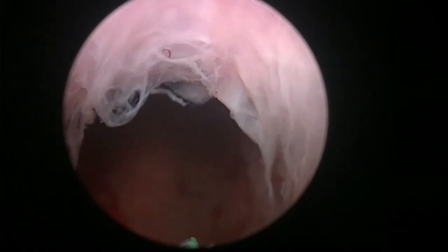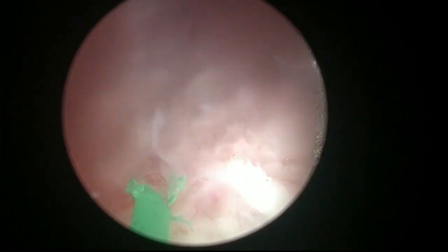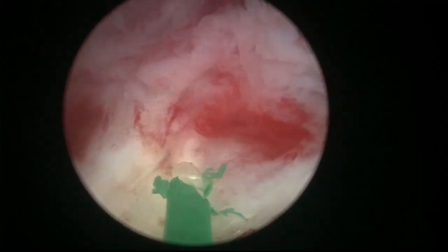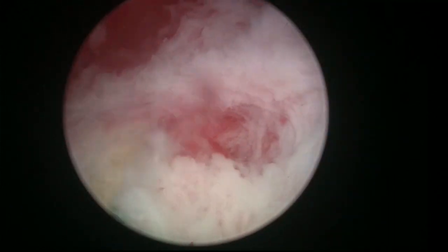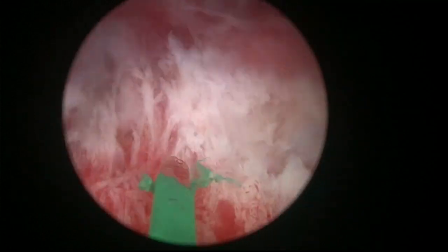And this is the prostatic fossa, and that is the sphincter, huh? This is the sphincter. So let's check hemostasis for a moment. So this, for a big prostate, was possibly a very, very fast enucleation time. My nurse is telling me that it was about 15 minutes. And I'm going to check the quality of hemostasis. Usually with Moses we get very good hemostasis as we go.